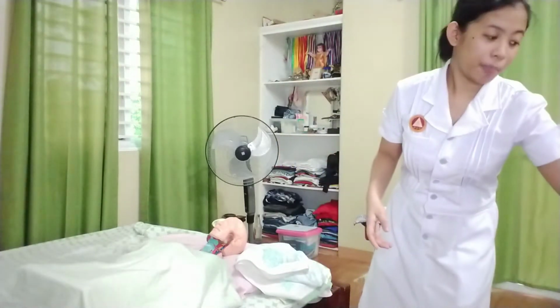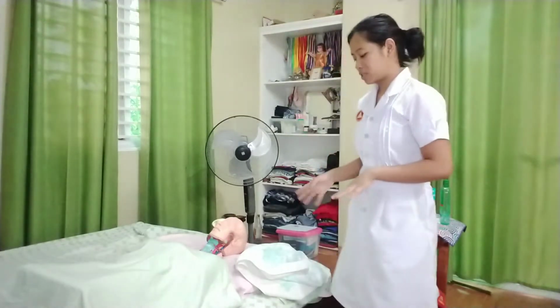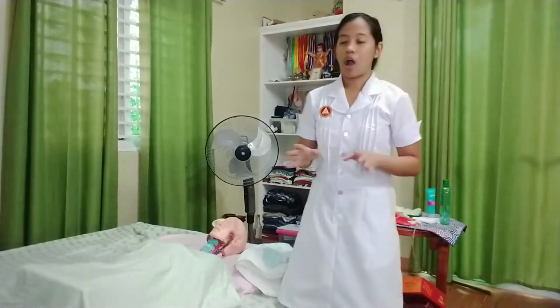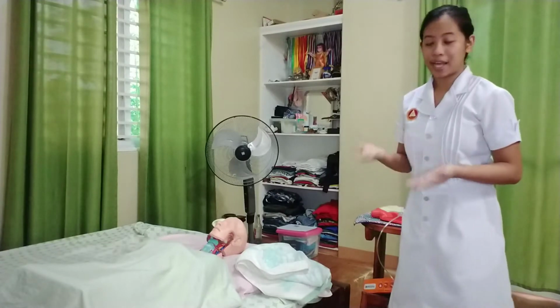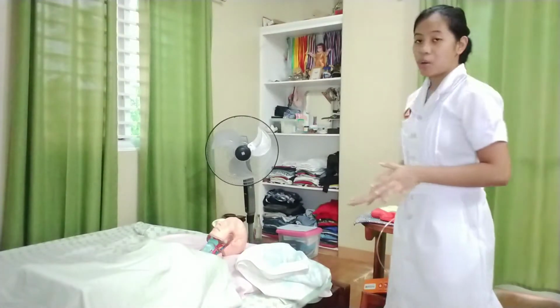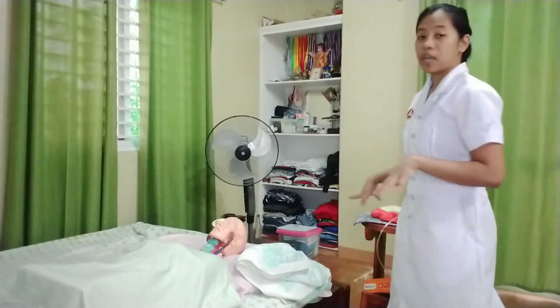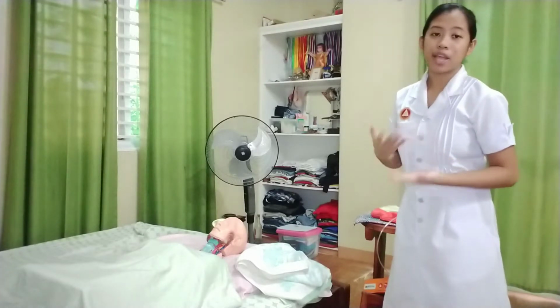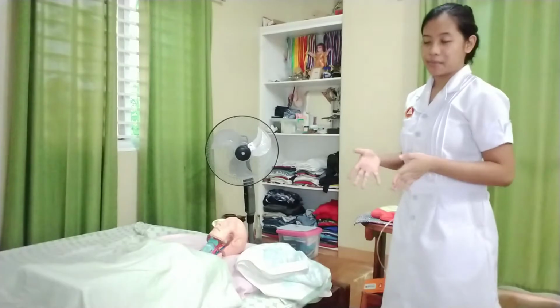So after that, I will now proceed to the preparation of the equipment I will be using. I will need a disposable linen saver pad, also a bath blanket, clean gloves, a water-soluble lubricant, and then a paper towel, and then also I will be needing the correct amount, solution, and the type and temperature of enema I will be using.